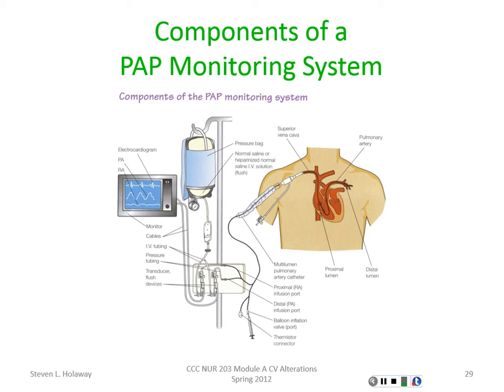But basically, the catheter is inserted through a central line. Then you thread it through and you're hooked up to the transducers. Typically you're hooking up that blue port and the yellow port to transducers. Those are the ones I'm going to be measuring pressures from. The white port is typically attached to an IV system of some sort to give fluids through them.